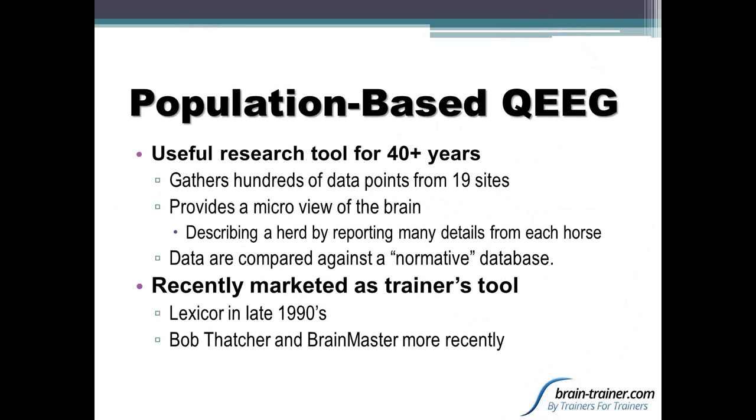So the QEEG, the population-based Q, which I'm going to call the PopQ from now on because it's shorter, has been marketed several times as a tool for trainers.